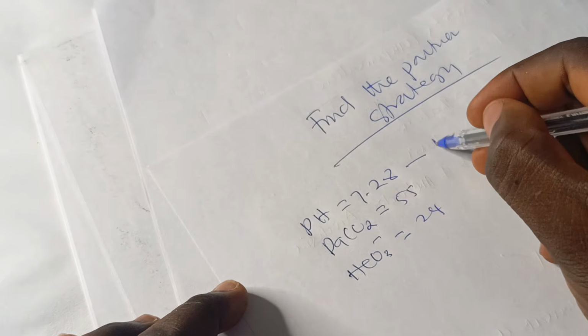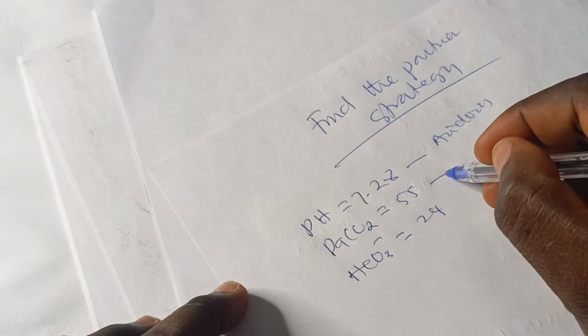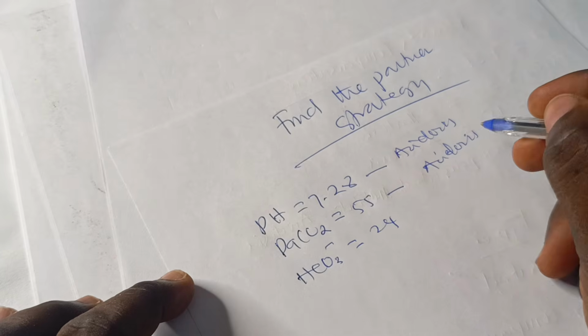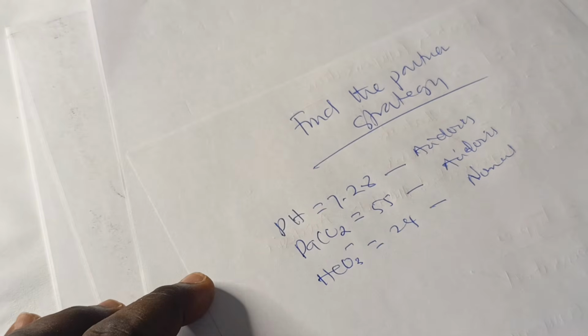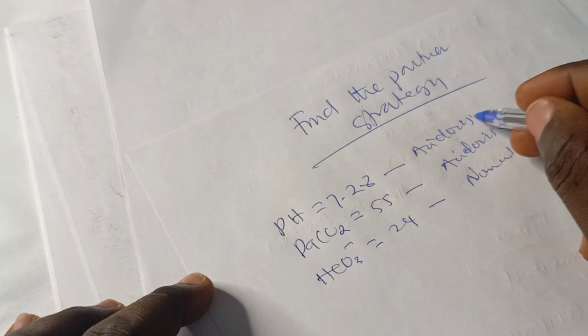So this is acidosis. Is this acidosis? Yes. This is normal. So what is the partner? What is it partnering with here?